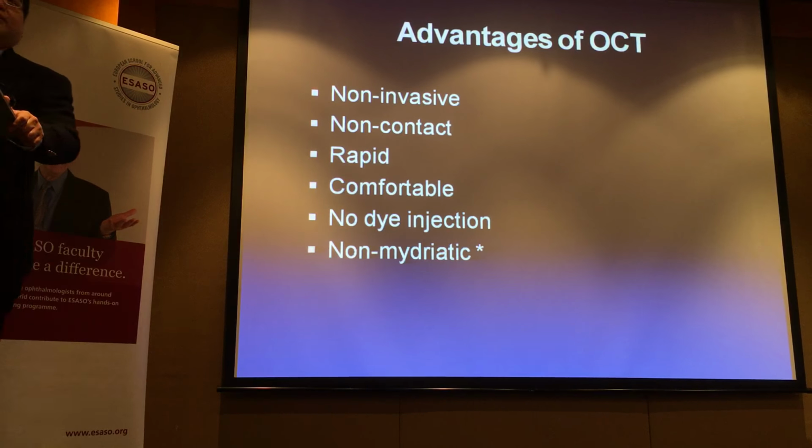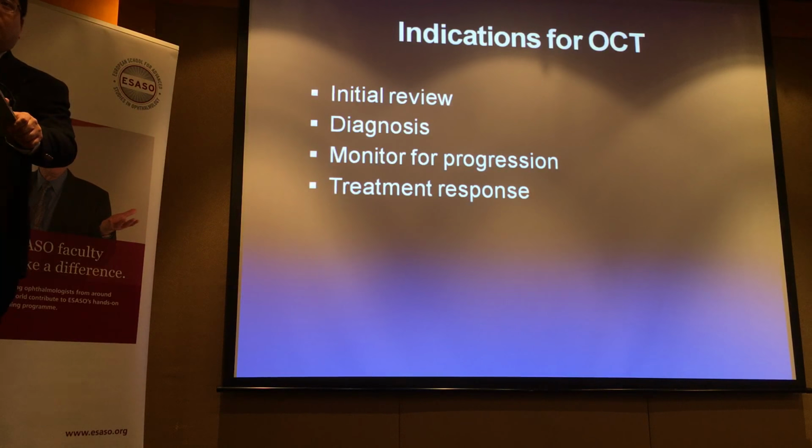So when do we do an OCT? I mean, this is really what we all do, right? During initial review of a patient, where indicated, you might do an OCT.